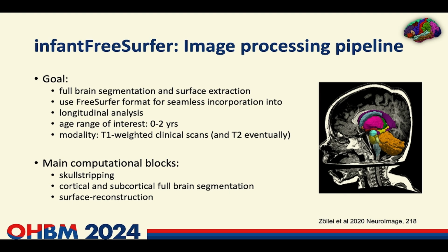And we wanted to keep to the FreeSurfer formatting and processing outputs so that later on, with any kind of longitudinal analysis, we can easily connect the different outputs and do easier comparison in case of multiple time point analysis.